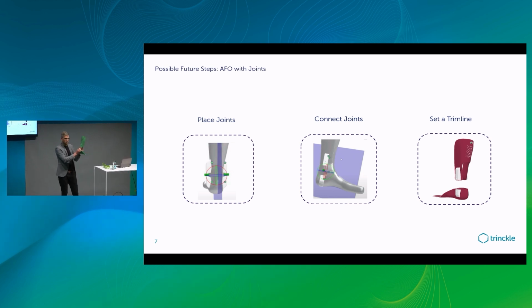the scan. So you cannot just place this one, and then separately the second one. It has to be precisely parallel, and you have to adjust that on top of the functional form. So that's a very delicate thing. We learned that if you do that in a manual design process, probably people will need 7-8 hours to do it really, really right. And this is something we need to speed up to make it accessible for the orthopedician.